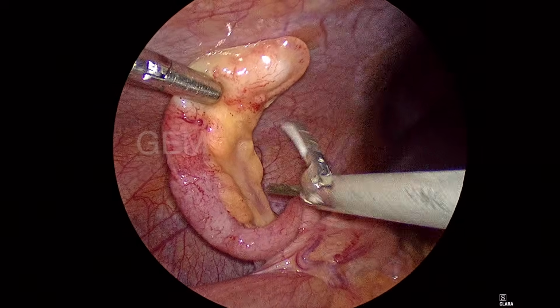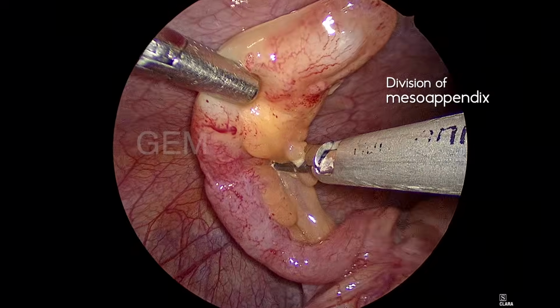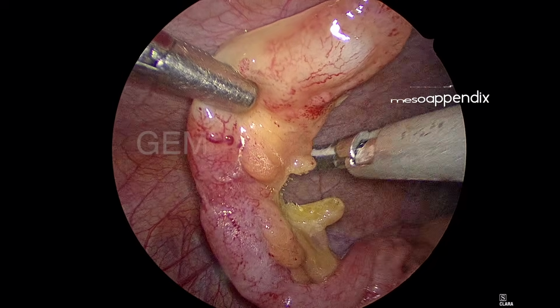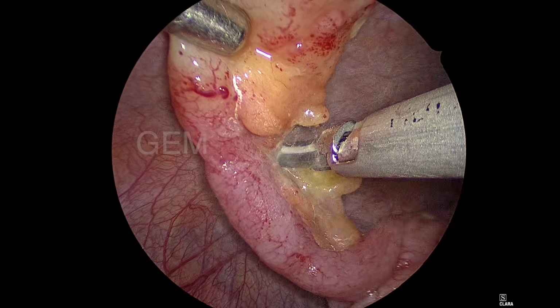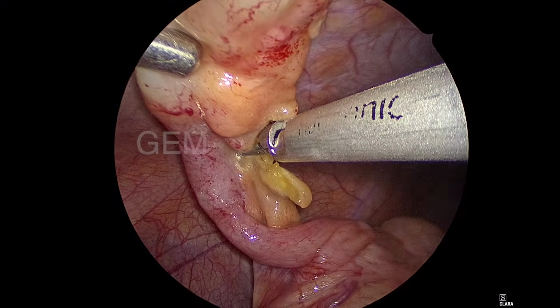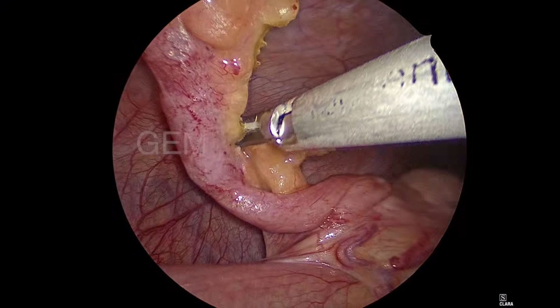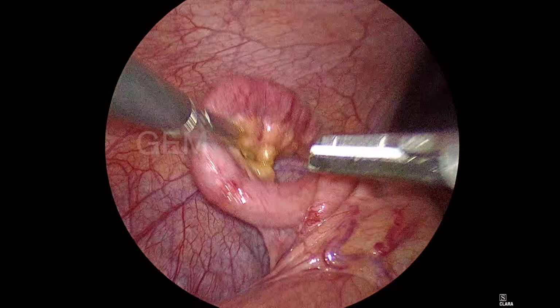I just want to show the various positions of the appendix in each video. So this is the paracolic position. I am dividing the mesoappendix with the harmonic scalpel. Always, any energy device you can use to divide the mesoappendix. Don't divide with the bipolar. Usually bipolar is not recommended to divide the named vessel, where the pressure will be more, like the cystic artery, appendicular artery.